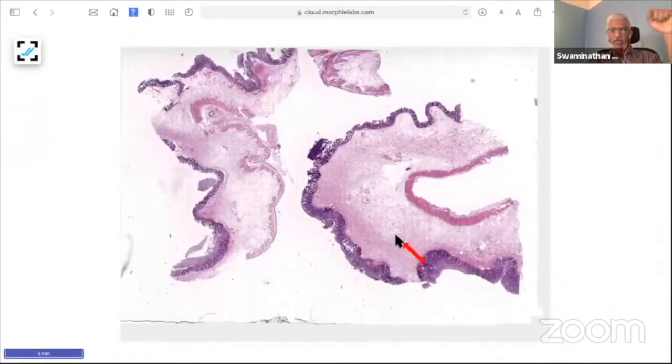Recently, last week, I saw a case where there is total ischemia along with some membranous area. Whenever there is total ischemia with membrane, you have to think of ischemic colitis. In pseudomembranous colitis, transmural ischemia may not be present. Remember, I showed you the crypts which are preserved.